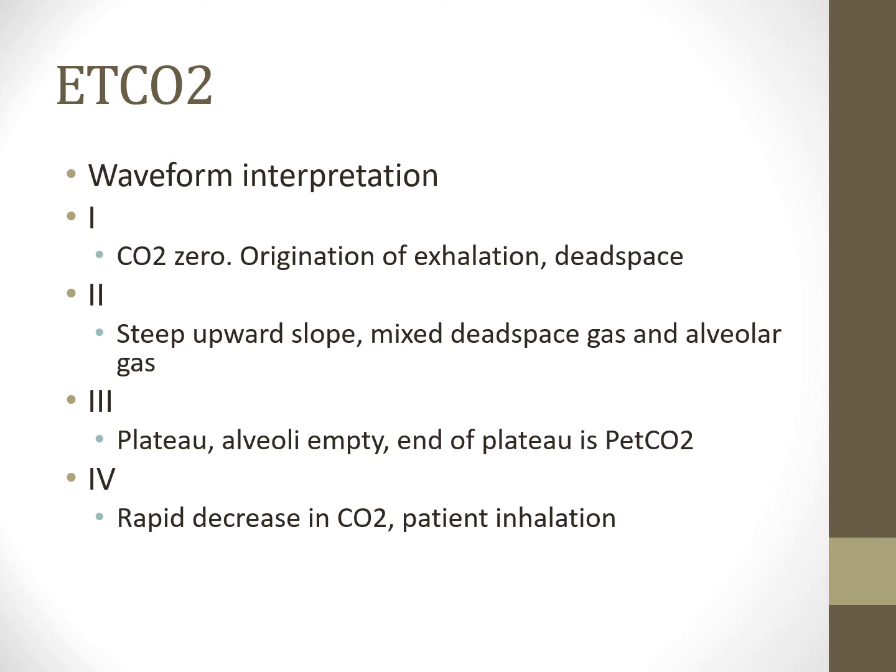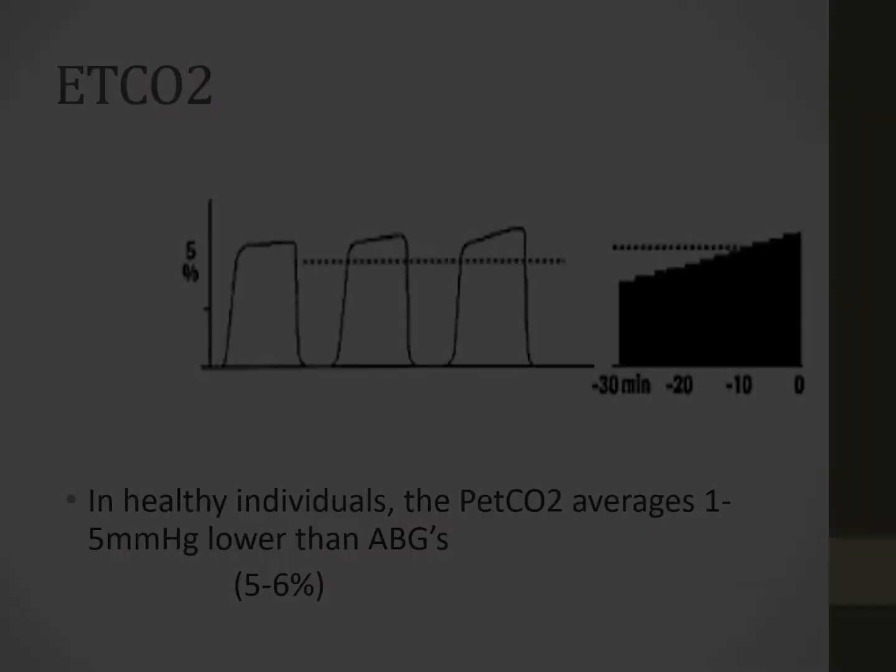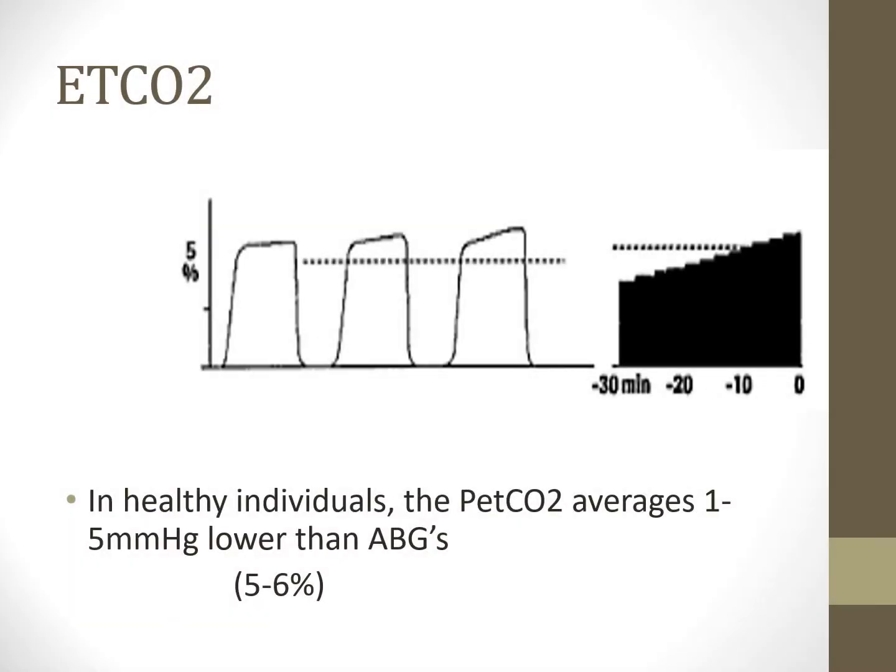And then finally, phase 4 is a rapid decrease in the CO2, and that means the patient is inhaling, right? So that means the gas is being moved in the opposite direction.